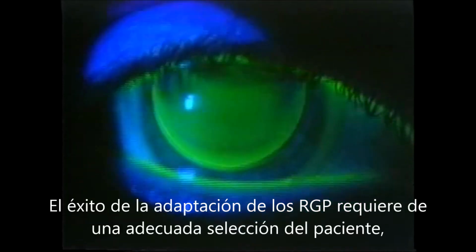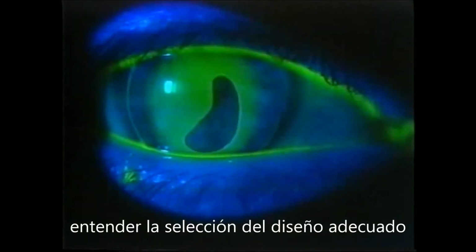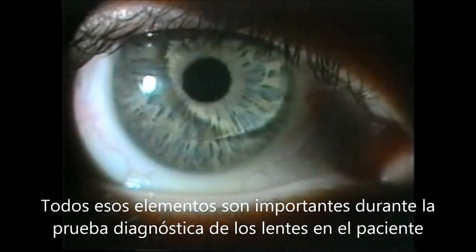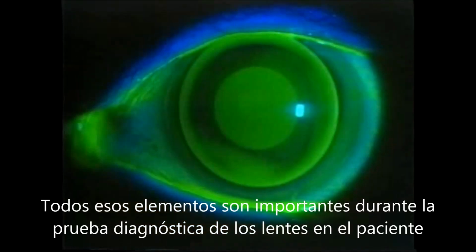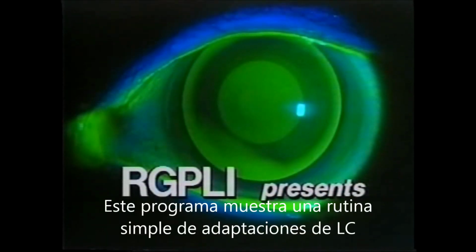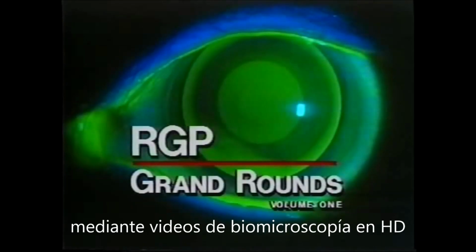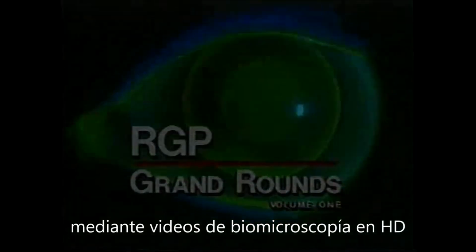Successful rigid gas permeable lens fitting demands careful patient selection, understanding of lens design principles, and knowledge of available materials. All these factors are important when selecting the appropriate diagnostic lens for the patient. This program features 6 routine and difficult to fit patients. Various lens designs and lens to cornea fitting relationships will be evaluated utilizing high-resolution video biomicroscopy.